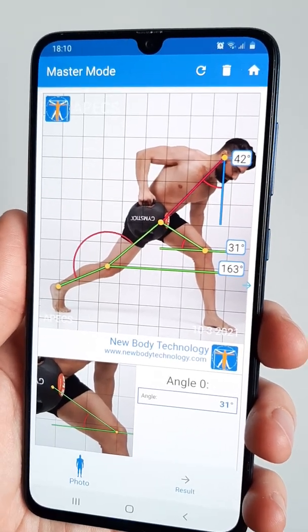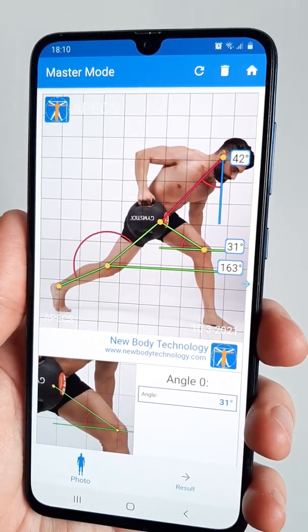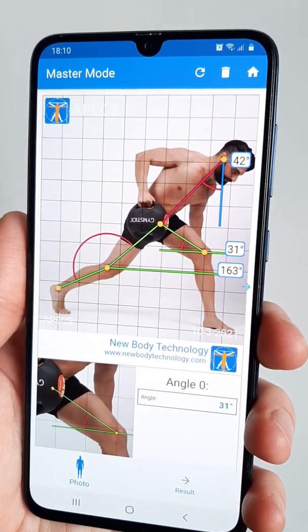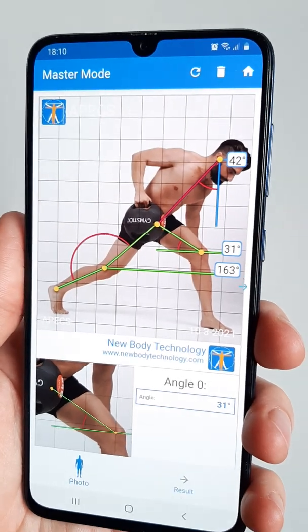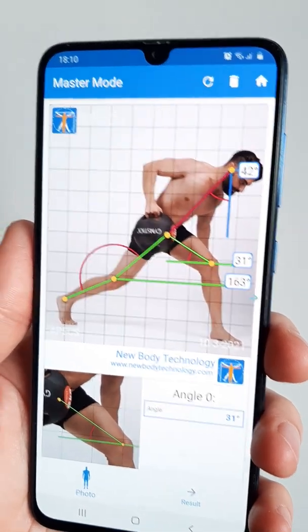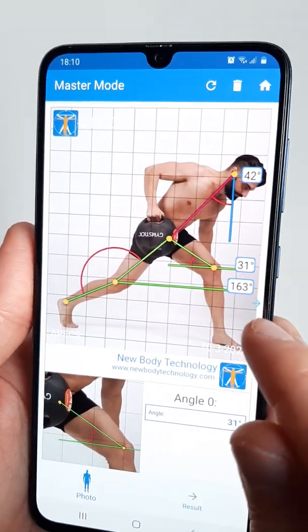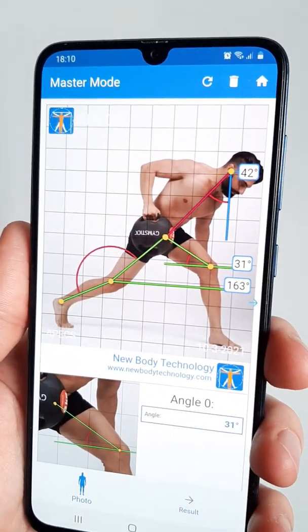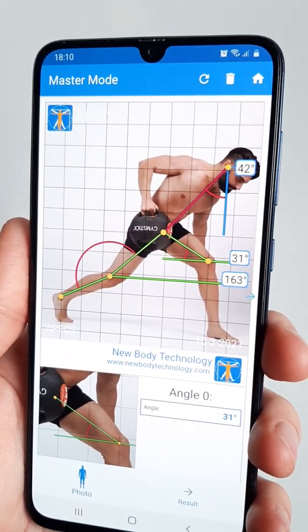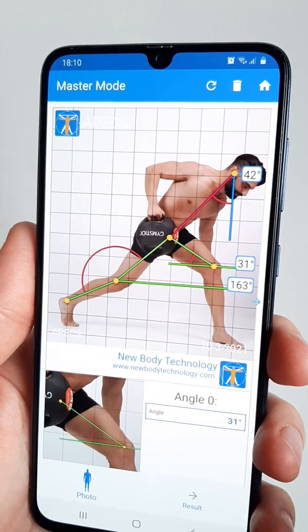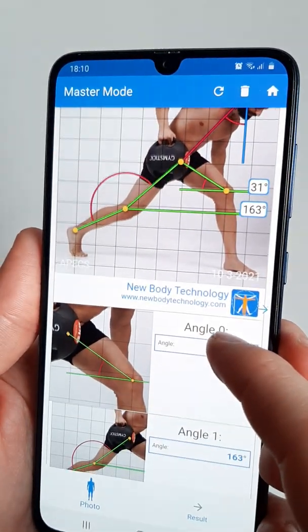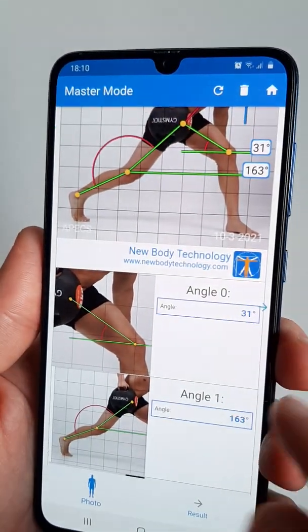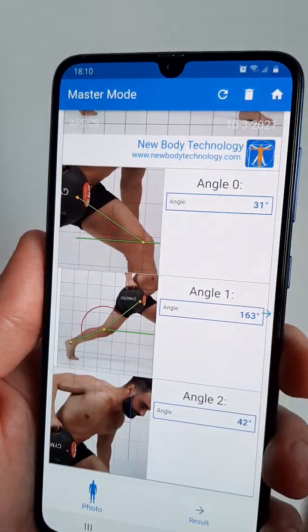Master Mode is designed for custom-made postural evaluations. In Master Mode, you have complete freedom to draw any angle you wish on the photo. It is developed for researchers and advanced postural practitioners who have specific protocols to follow and measurements to take.